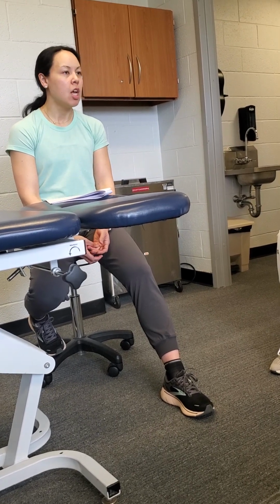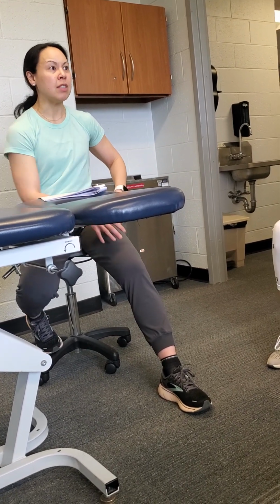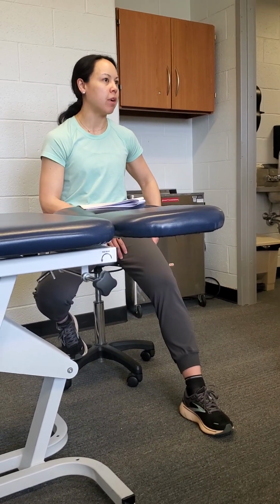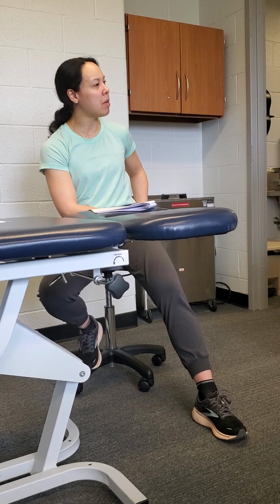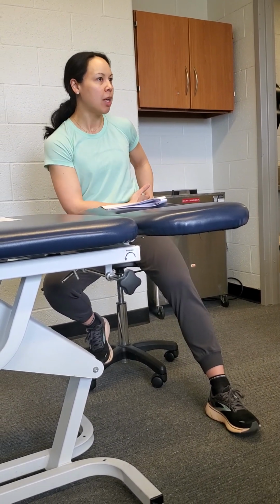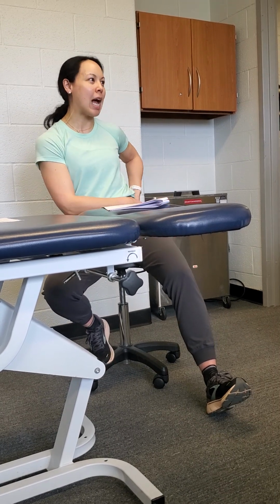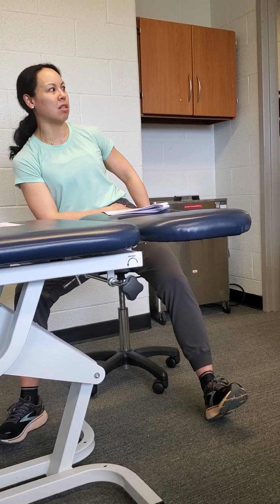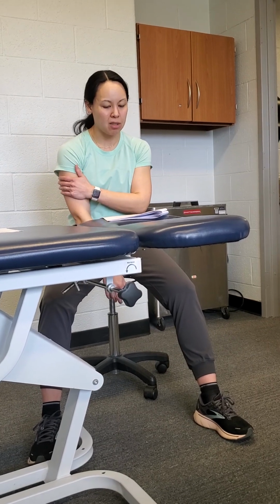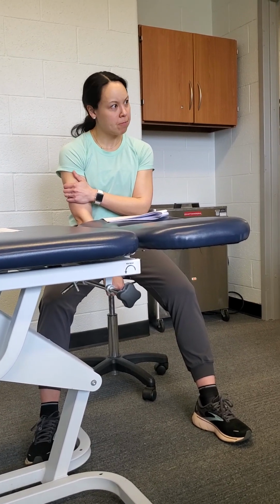Okay. It's not an issue at all. Especially if it's the knee or the ankle, it's more about the cuff placement and pressure, right? If the cuff isn't near the incision, maybe be a little more careful for the hip. But even then, with a total hip you're probably not going to have an incision there unless it's a big incision. Then I would say be more cognizant of that. I wouldn't do it if it hasn't healed yet. Does that answer your question?